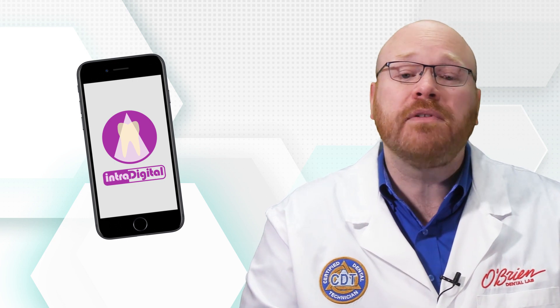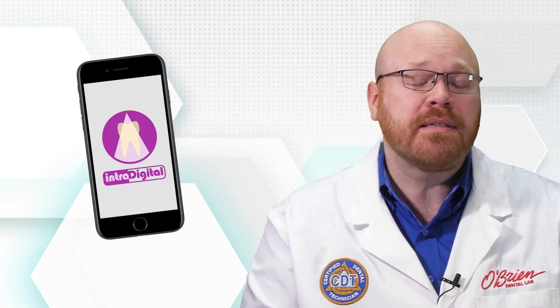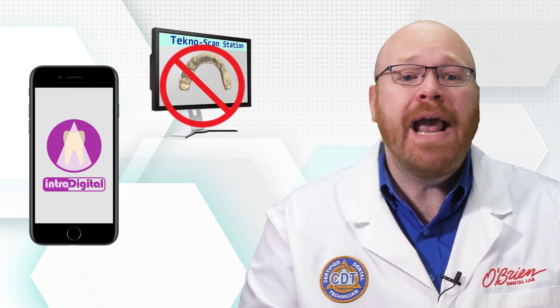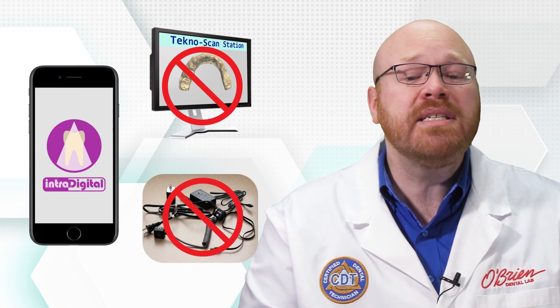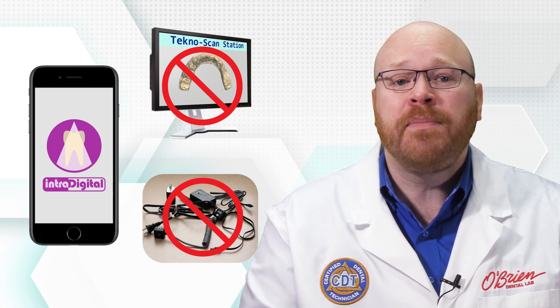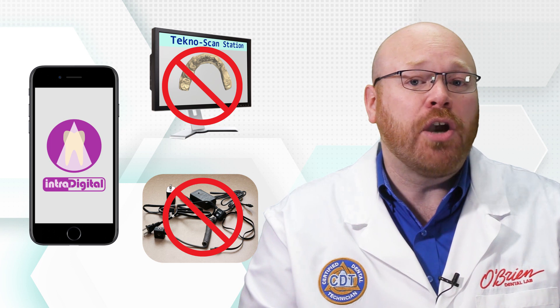This is truly a revolutionary product for several reasons. First of all, this doesn't require a separate computer to run, and there are no annoying cables to deal with. The system runs independently on your smartphone, which simplifies the entire process. You just download the app and you're ready to go.